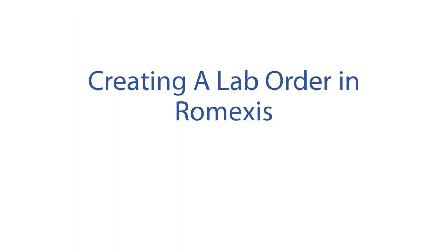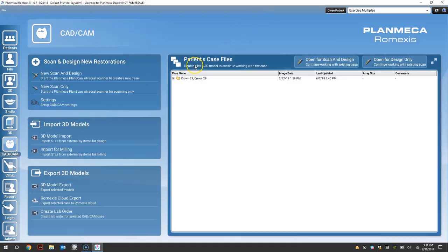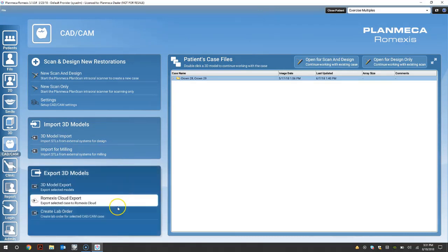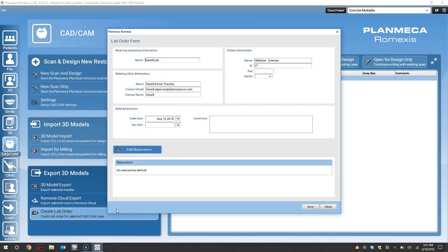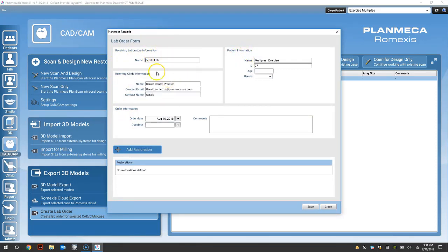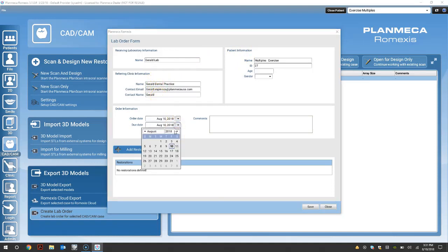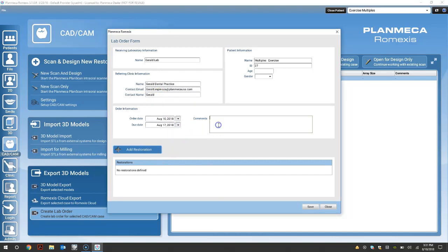Creating a lab order in Planmeca's Romexis. Highlight your restoration. Select create lab order. Enter your lab information. The patient's information should be filled out and enter the practice information. Select your due date. Make any comments.